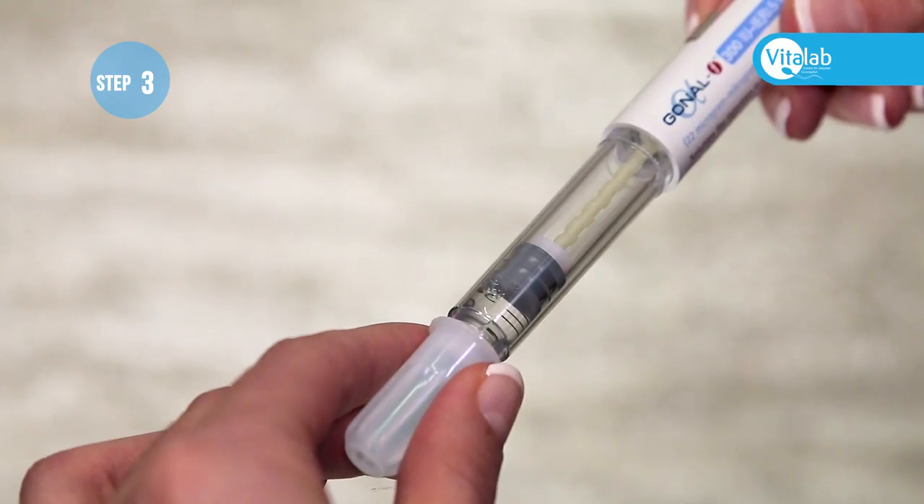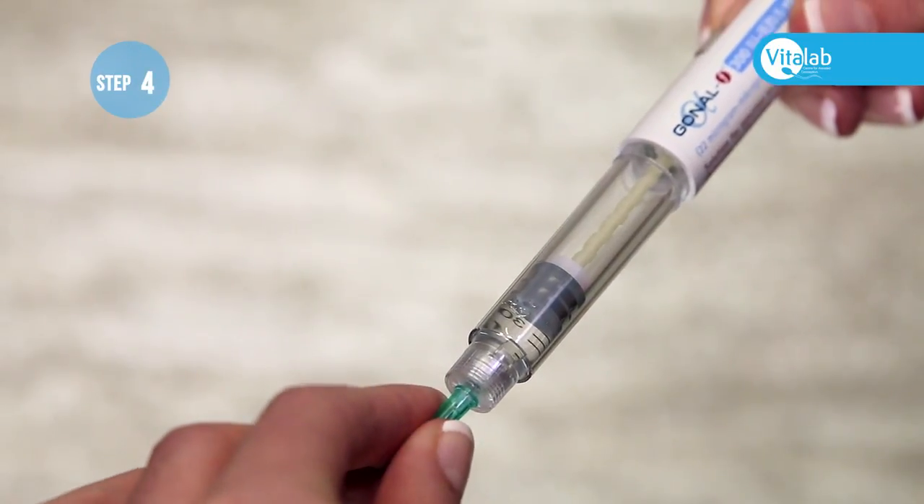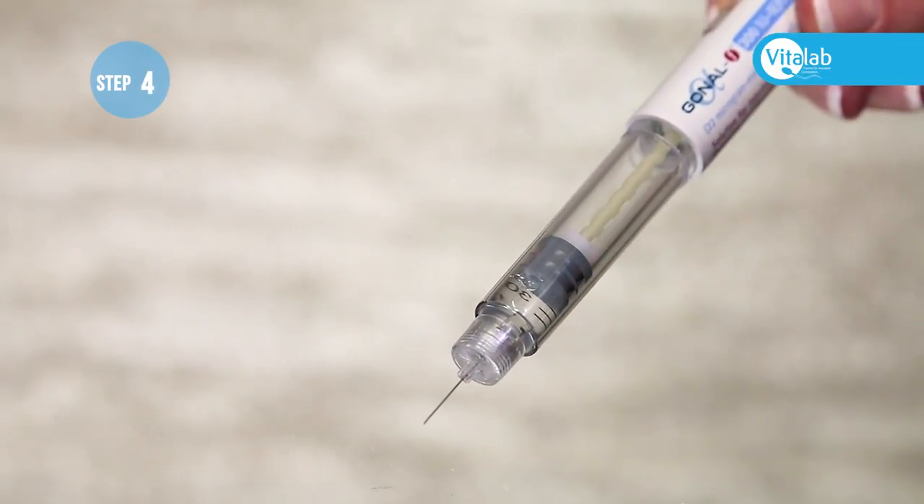Then remove the white plastic cover. When you are ready to administer the injection, remove the green plastic needle cover.